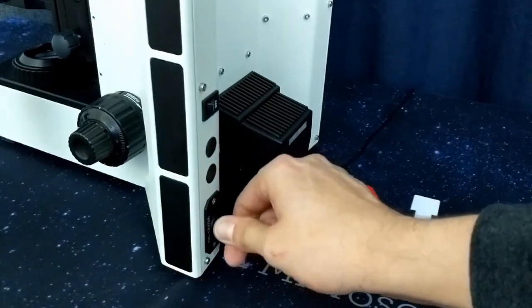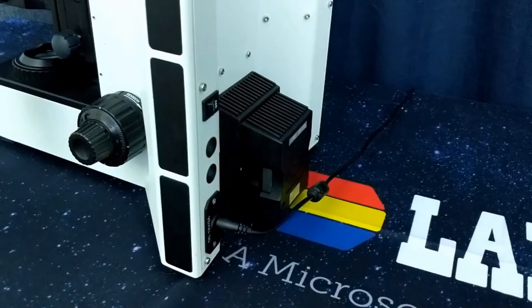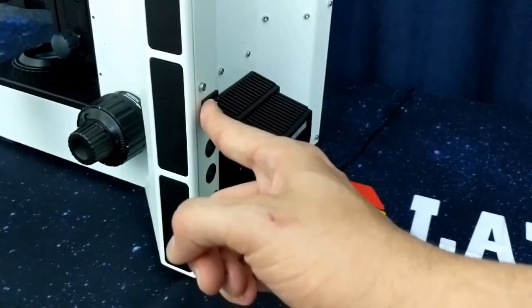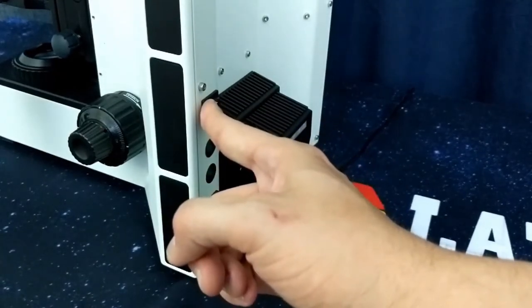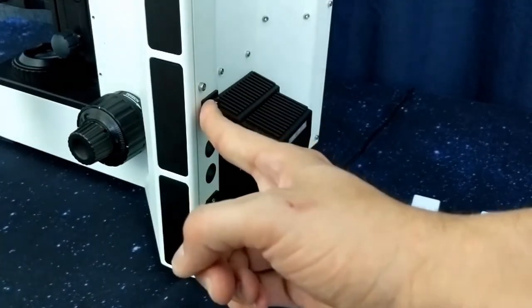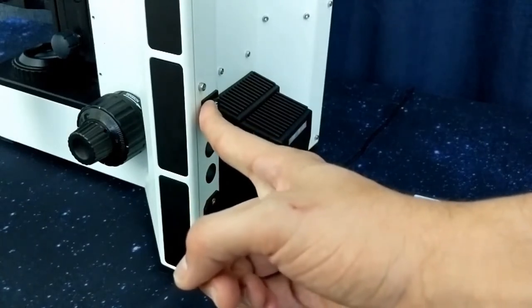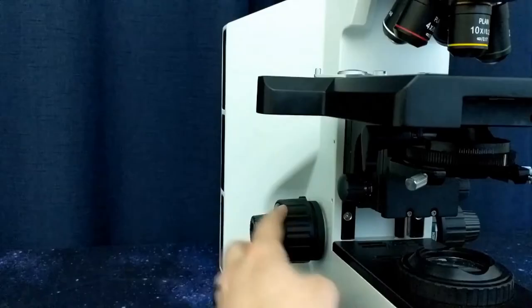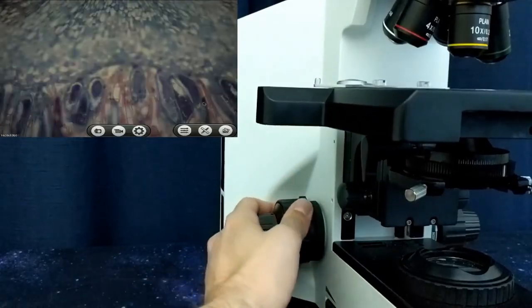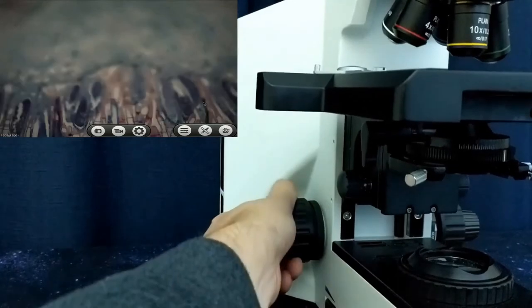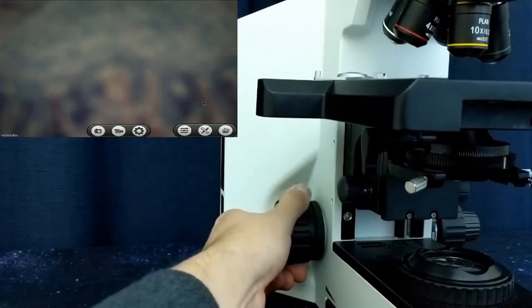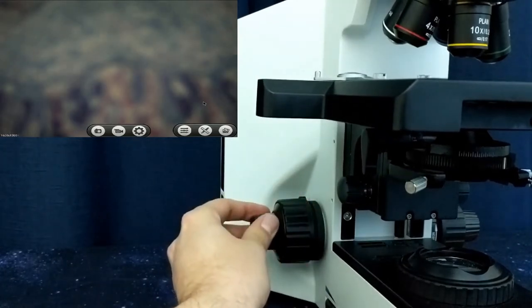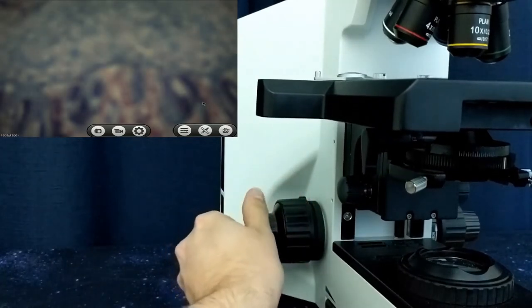Plug in the microscope, then push the power button to the on position for at least 5 seconds to ensure that the system boots up and that the illumination turns on. Using the coarse and fine focus knob, bring your sample into a nice, crisp, clear focus.